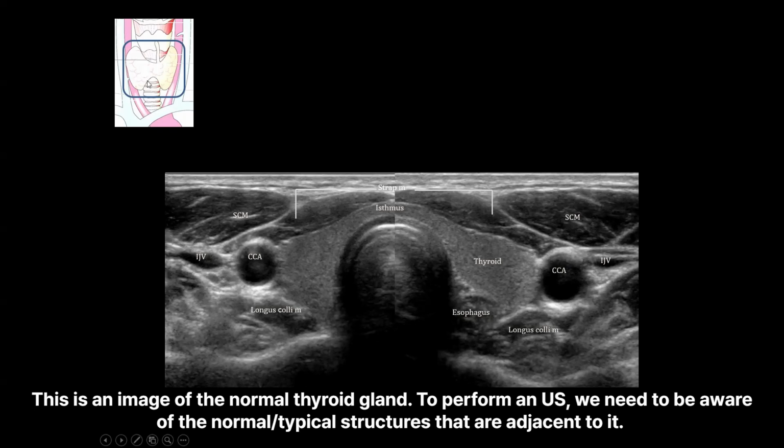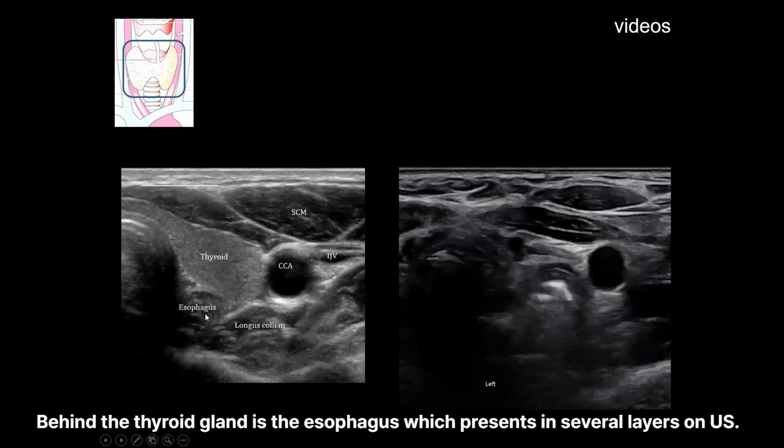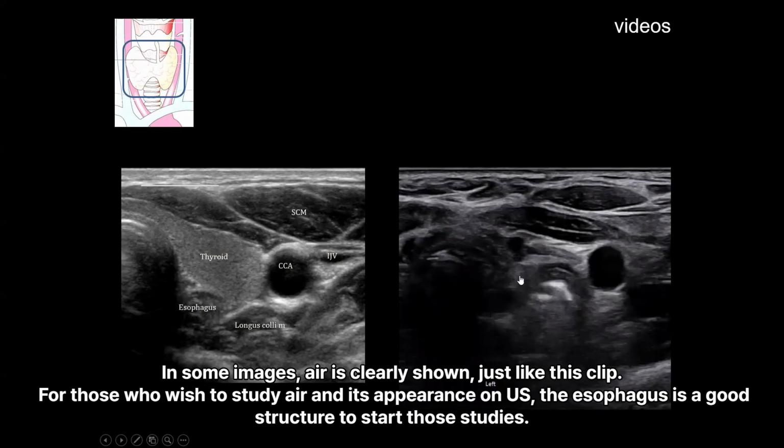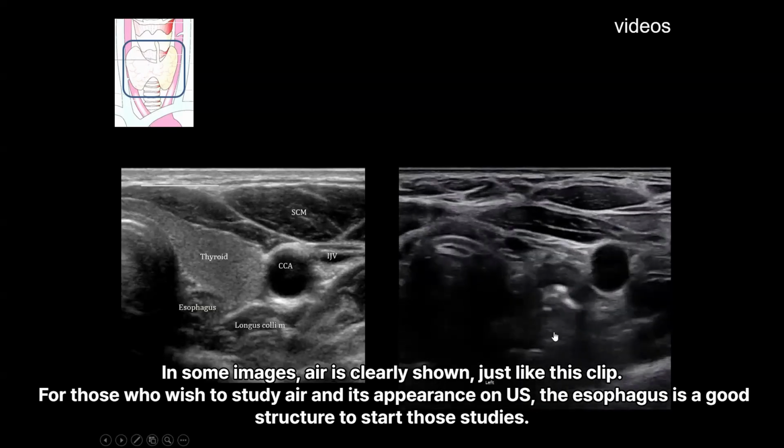This is an image of the normal thyroid gland. To perform in US, we need to be aware of the normal typical structures that are adjacent to it. Behind the thyroid gland is the esophagus, which presents in several layers on US. In some images, air is clearly shown, just like this clip. For those who wish to study air and its appearance on US, the esophagus is a good structure to start those studies.